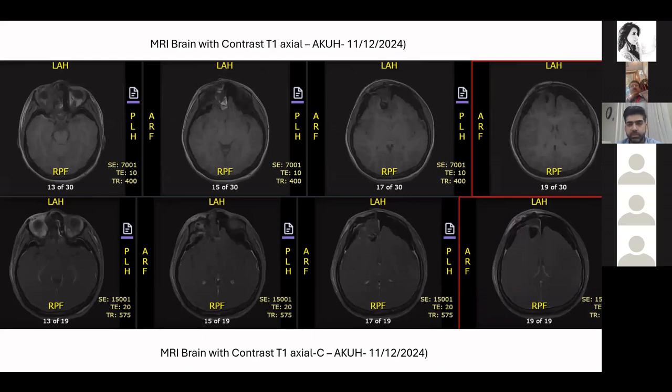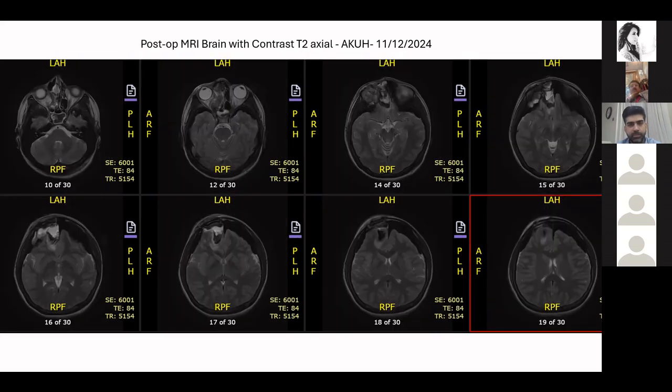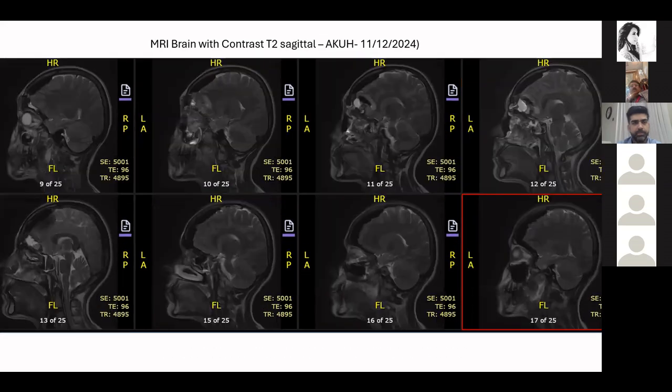So if you go through the post-op images, especially the sagittal images, which are, I think, the fourth slide in a row, there appears to be some residual lesion in the line of the surgical tract. And the thing is that olfactory neuroblastomas, if we stage them, are staged as A to D. In stages C and D, there is a possibility of lesion beyond the olfactory epithelium, and distant metastases are part of this disease spectrum. They can present with distant metastasis.